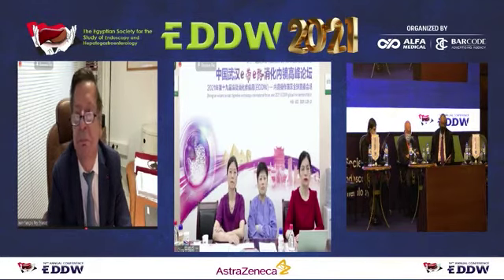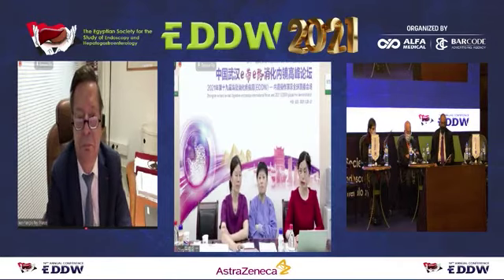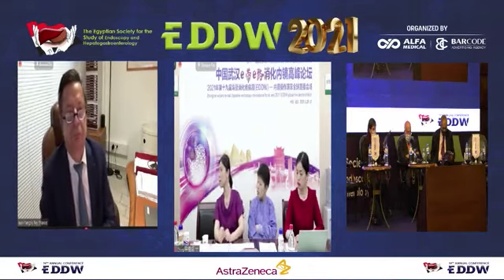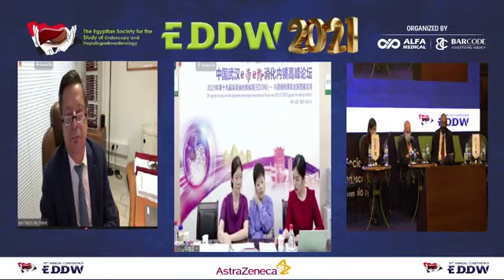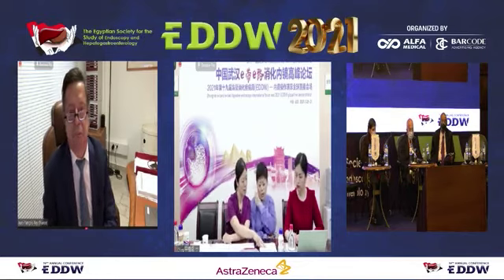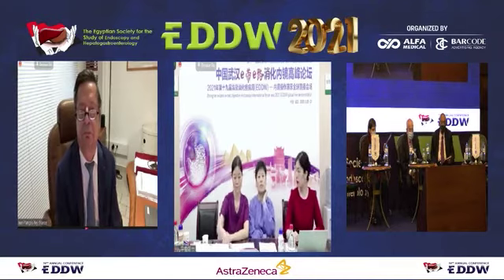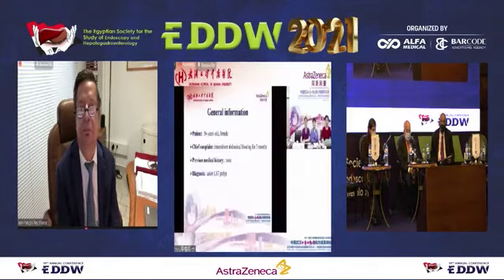Yes, because we are short of time. Yes, we can go for one of the EUS demo cases. Yeah, the next case is EUS. Dr. Fang? The next case. So we are done here. We will show you the next case.